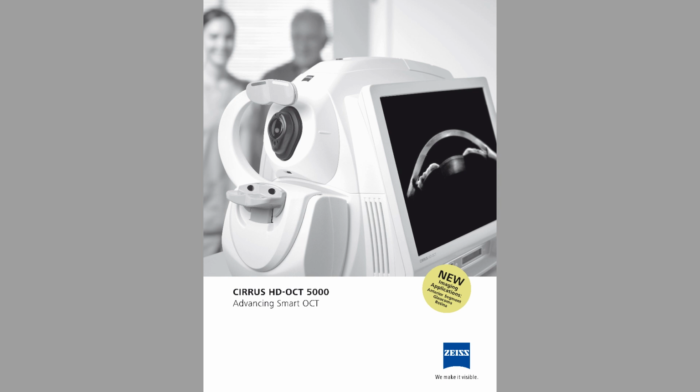Sure. It really depends on what your workflow is. We have the whole eye that you could possibly image, so it's a matter of seconds to take an individual scan. If you took a macular cube and, let's say, a 3x3 or a 6x6 angiography scan, you could take that in about a minute per eye. So a couple of minutes if you really had your workflow and knew what you wanted. So it's less than 5 minutes per eye if you do the whole enchilada? I would say you could do both eyes in 5 minutes.